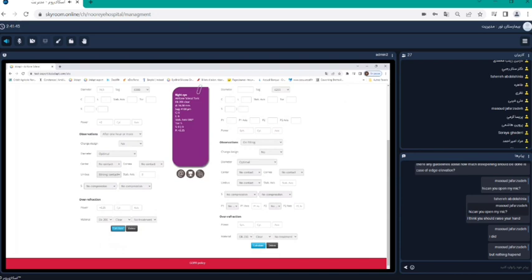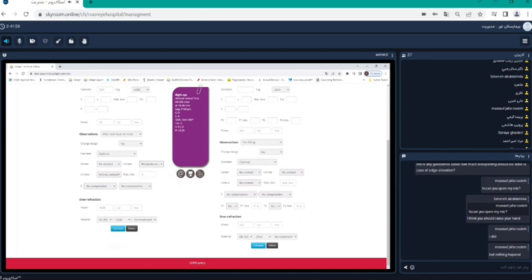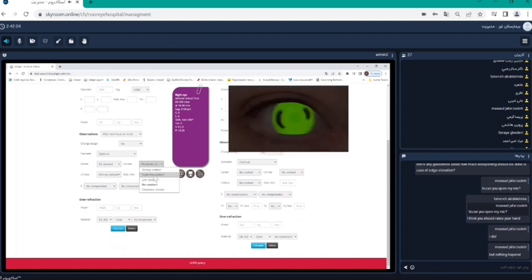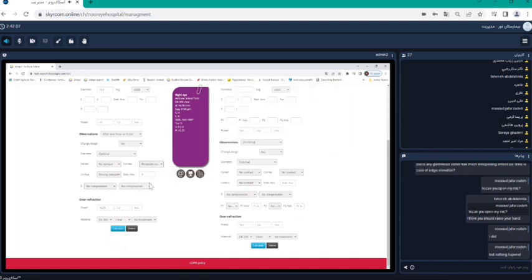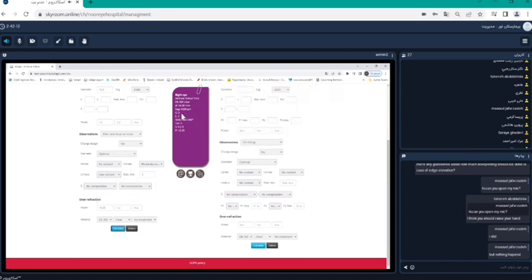How much do I have to change when I have a contact somewhere? If, for example, I had a contact also here, not at the limbus, but in the paracentral area, say calculate. So you see, moderate, calculate. Oh, it does not want it like that. Low contact. Okay. So that will change the C here. Plus 2. So when you do that, you then have 3 possibilities.